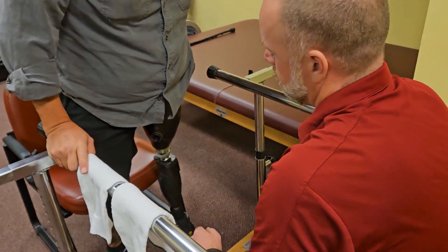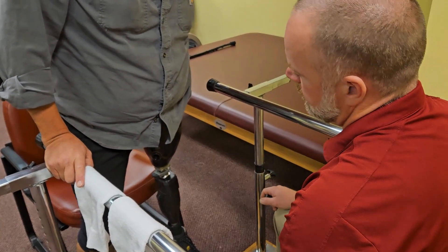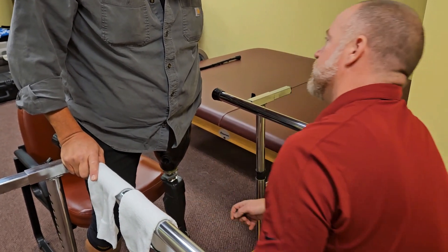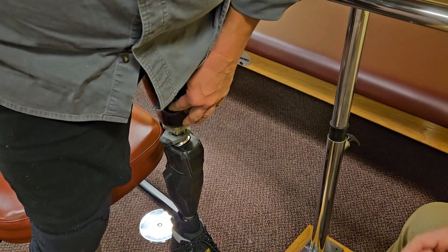When standing up to put this on, get a little bit of a wider base and keep one hand on a bar or counter to stay safe. You can take your finger and feel the end of your limb down there.